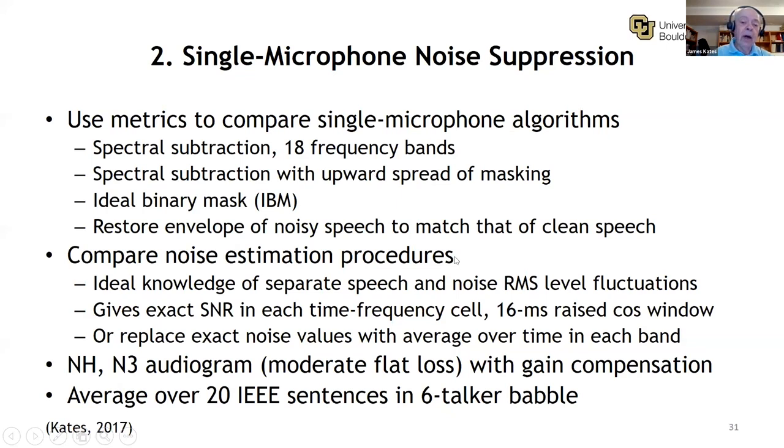We also compared noise estimation procedures. In the ideal binary mask, for example, you assume you have the speech and noise as separate files.